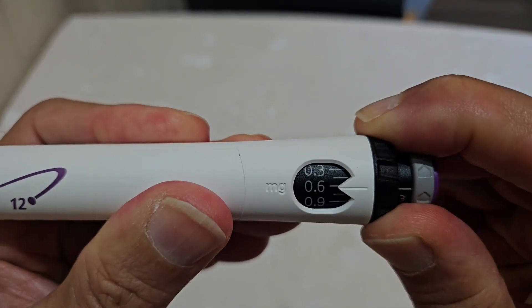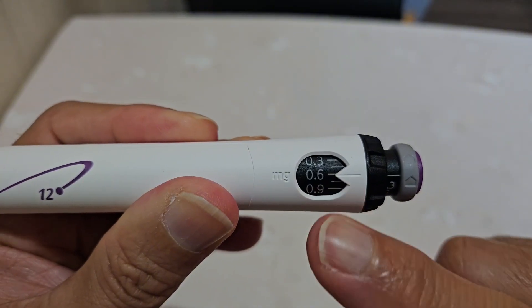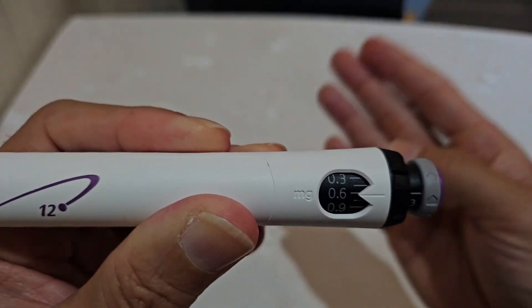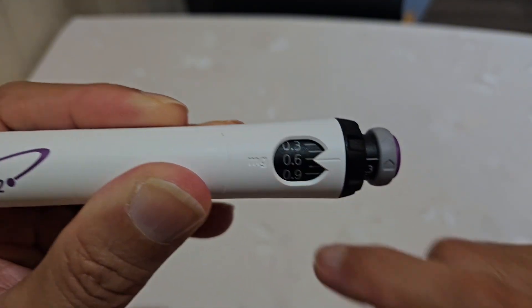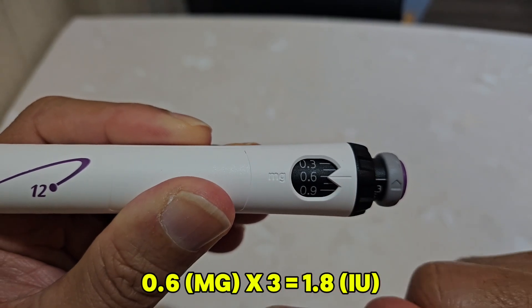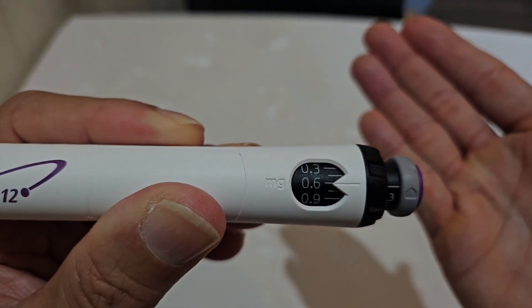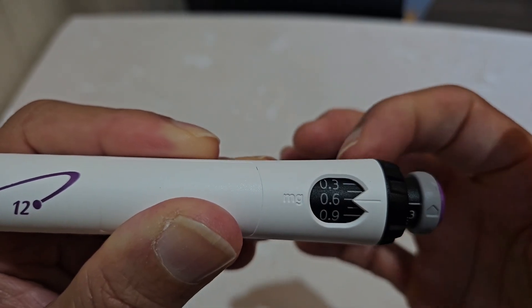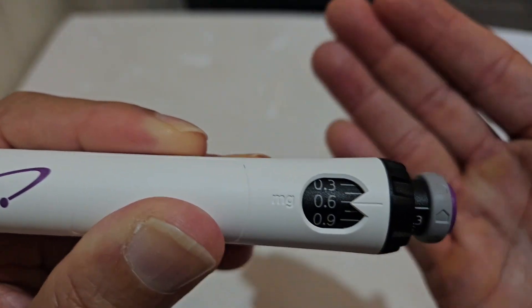Every time you switch the dial, you are changing the number of milligrams you inject each time. If I set it at 0.6 — as I might tell you in your specific plan — how many international units are you injecting? Remember the magic number: 3. Multiply 0.6 by 3 and you get 1.8. So if you set the dial at 0.6, each injection delivers exactly 1.8 international units of growth hormone. Unfortunately, the Genotropin pen doesn't allow you to deliver exactly 2 international units, but that's fine.